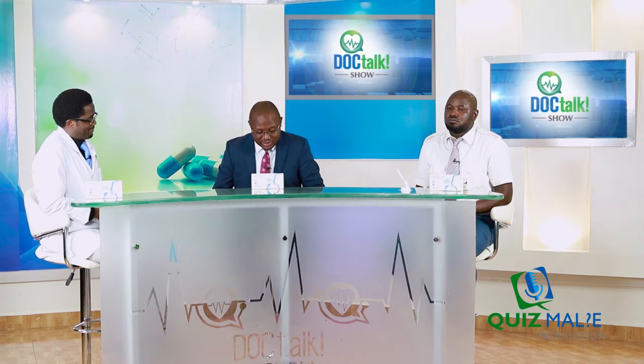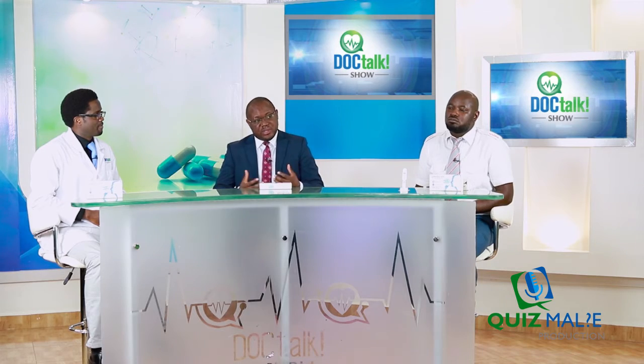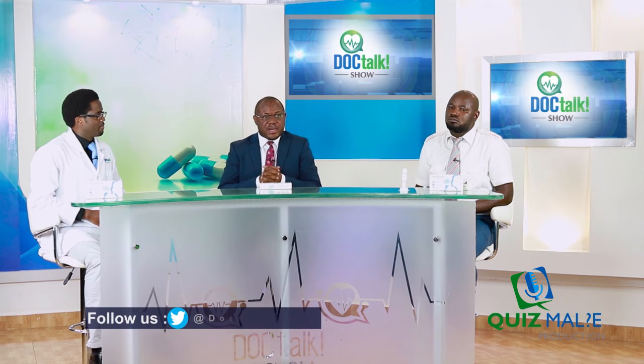The test is actually accurate. It's as good as the test that we do in the hospital. If you read on the box, the manufacturer puts the accuracy at 99%, and actually not very different from what we currently use in the hospitals. The blood-based kits, 99.5. So the difference is not really much.